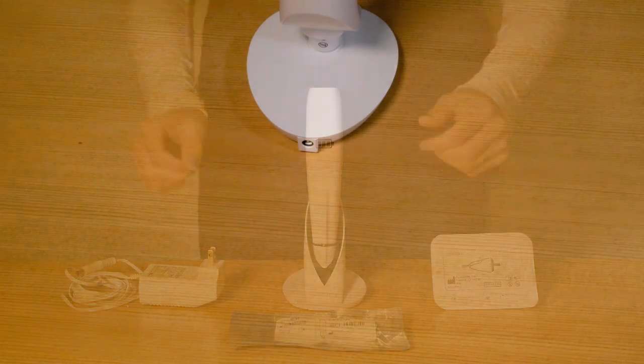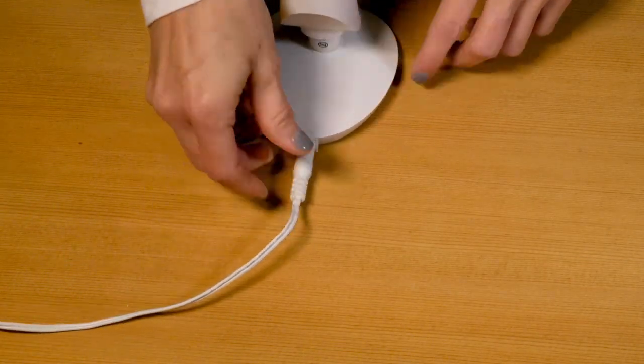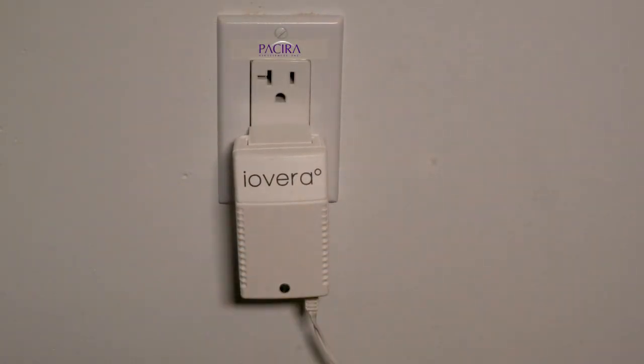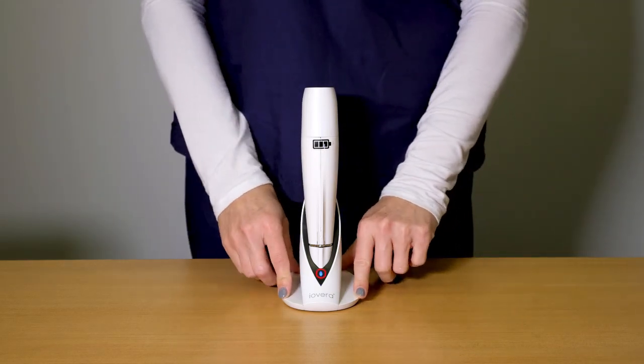To charge your iOVERA handpiece, plug the small end of the adapter into the back of the iOVERA charging dock, then plug the two-prong end into a wall outlet. The charging dock has an LED to indicate it is receiving power.